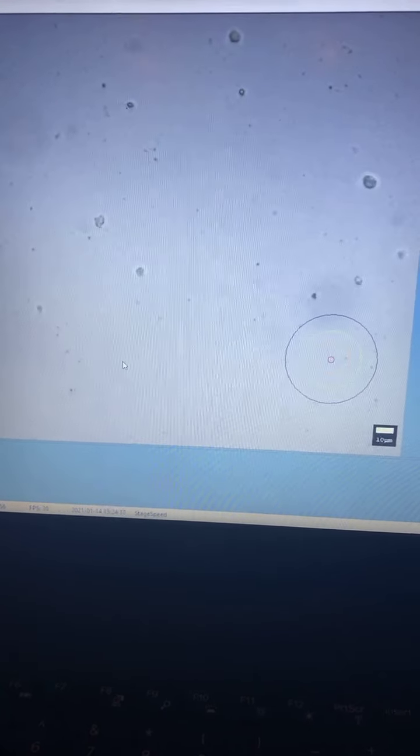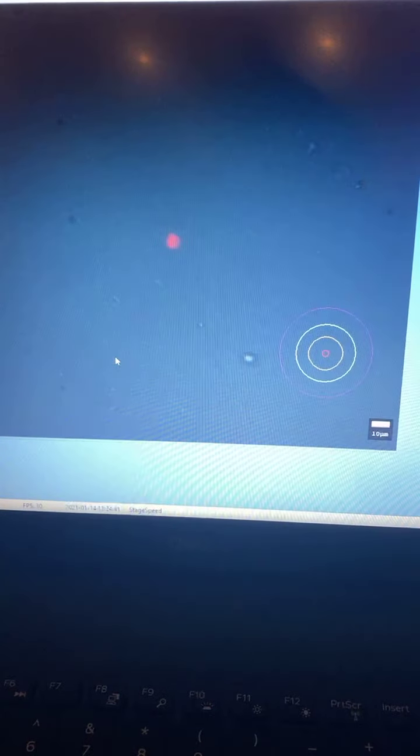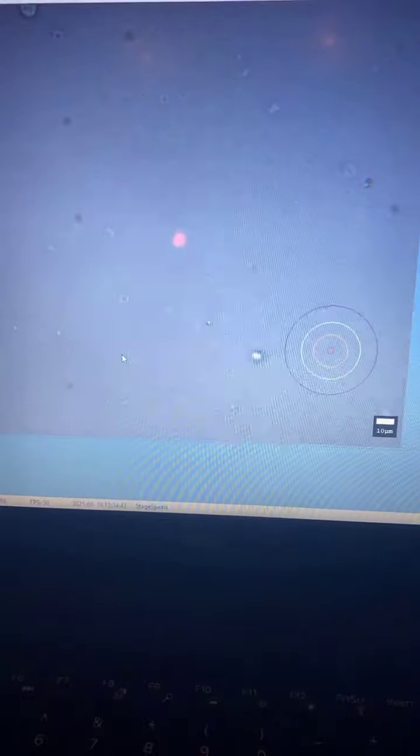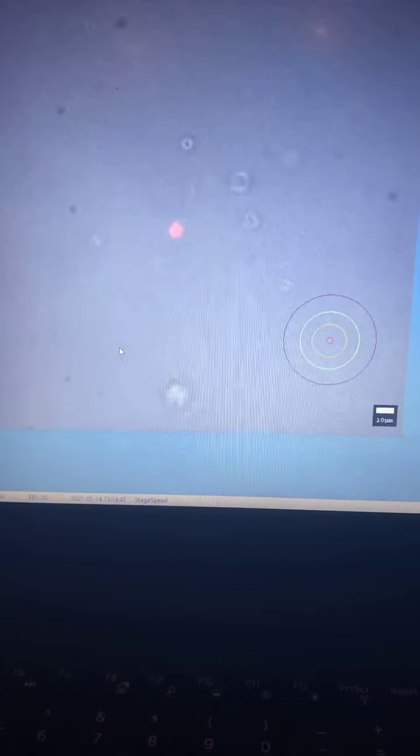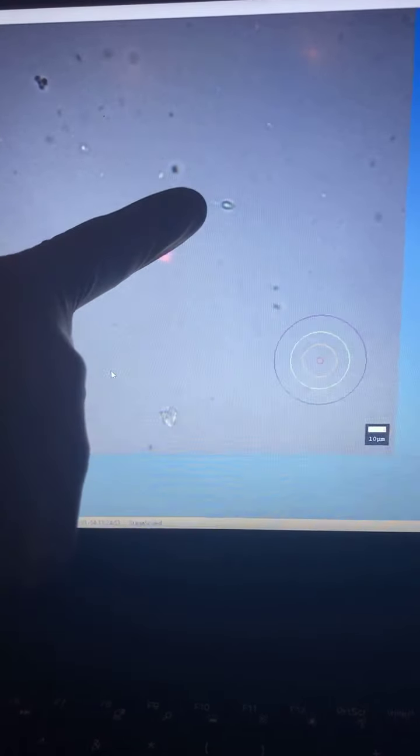Here is our first sperm — right in the center. I'm going to zoom it down further. Absolutely in the center of the screen you can see the first sperm. This is sperm number one. I have 14 eggs which I am supposed to do ICSI on, so I've got one sperm already.